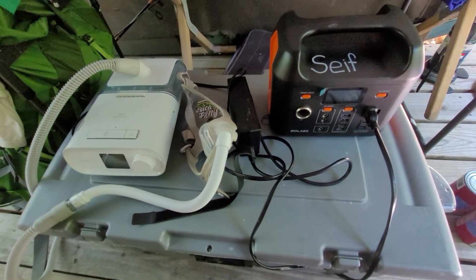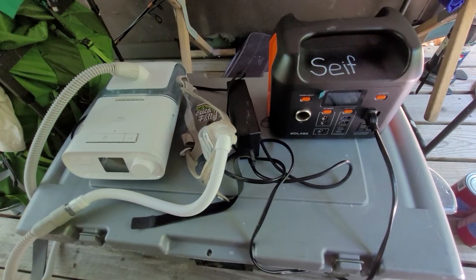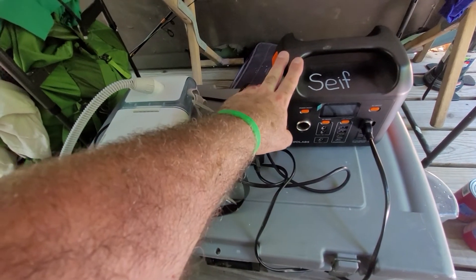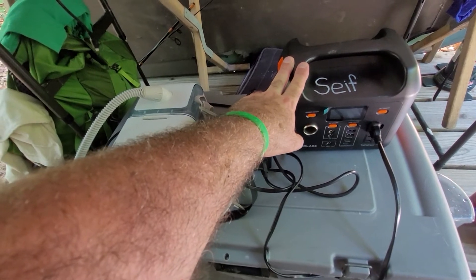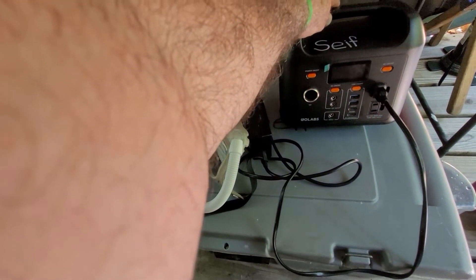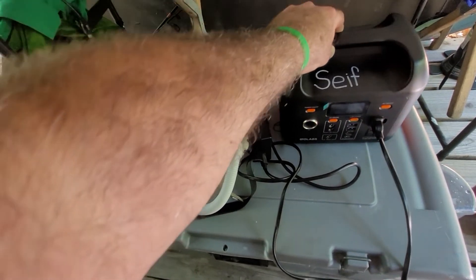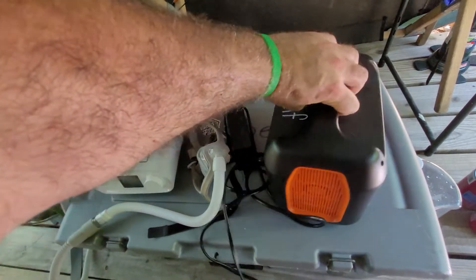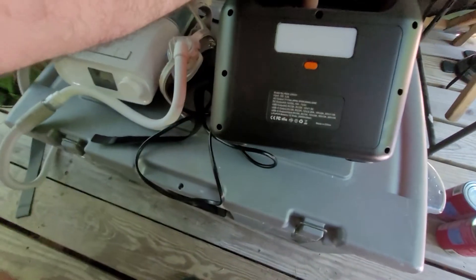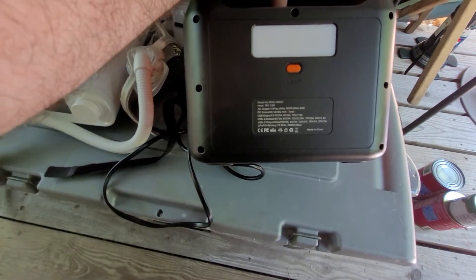I don't really go anywhere too remote. If I'm going backpacking overnight, I just don't bring my CPAP machine and I get terrible sleep. This is the GoLabs R300 — that's the model number. I think it has 300 watts maximum and it's 299 watt hours.